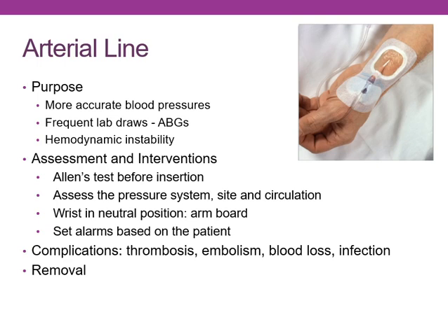One more note is I do see sometimes arterial lines are left in when they no longer work correctly. And the nurses are like, oh, we're going to use it for blood, and they might turn the alarm off. Well, think about this. What if something happens and this line comes apart? It comes apart somewhere up the system. Your patient could bleed out. So that's poor practice. If it doesn't work, we need to get an order and let's get it DC'd because they're at risk for infection. And if it's not working, we just need to get rid of it.